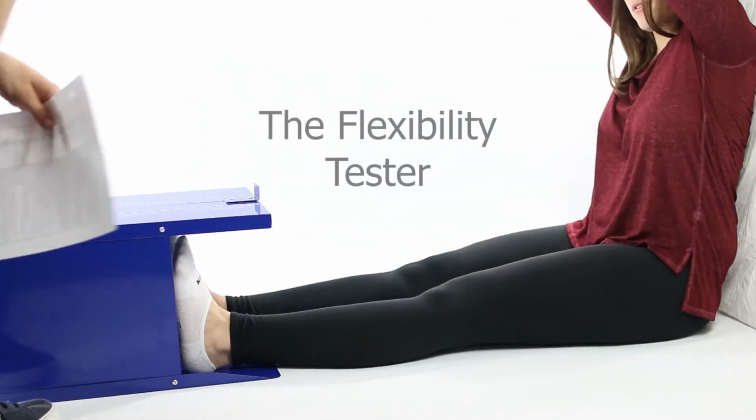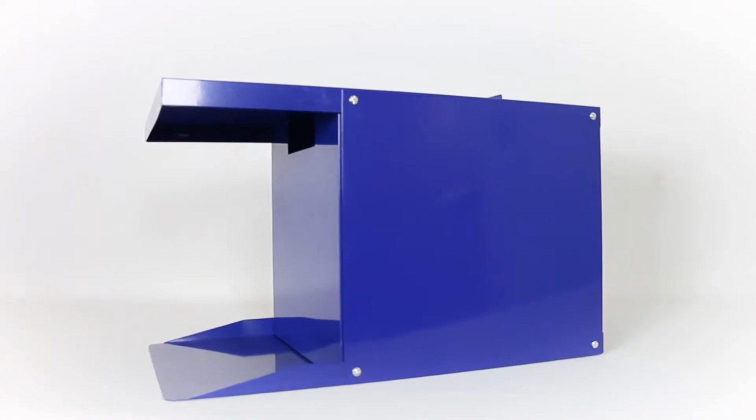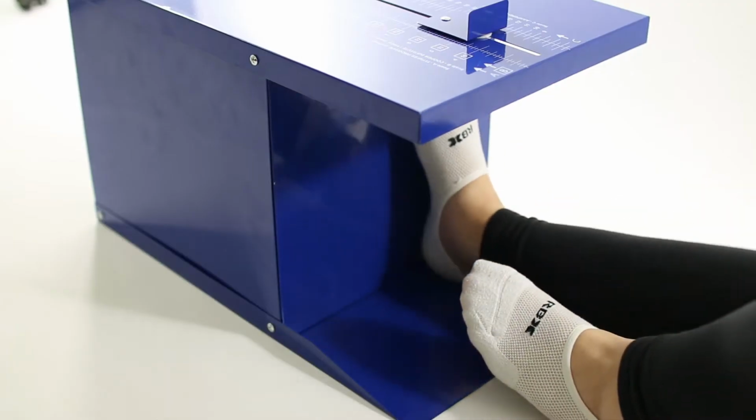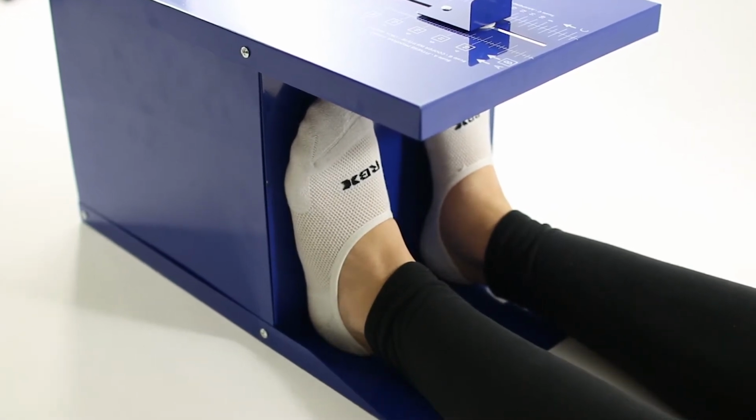Using the baseline sit and reach. Before performing the standard flexibility test, make sure the subject is warmed up. Remove your shoes and place your feet squarely against the box, no wider than 8 inches apart. Have your toes pointed toward the ceiling.